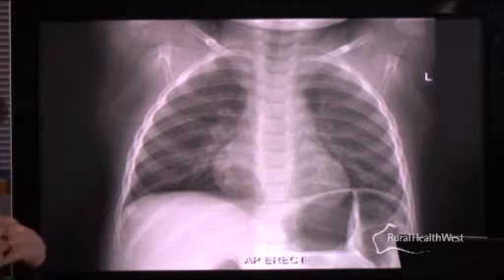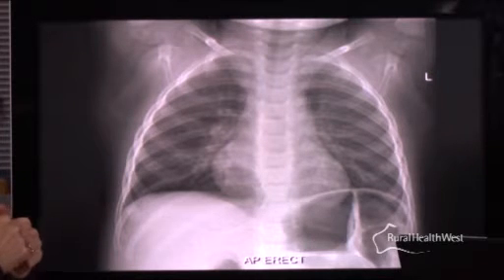And in a young patient of this age with these findings, the appearances would be very suggestive of bronchiolitis due to respiratory syncytial virus or other type of viral infections. Because it's fuzzy and diffuse, but that looks like it must be quite a sick little kid. Yes, but there's no actual pneumonic consolidation present.